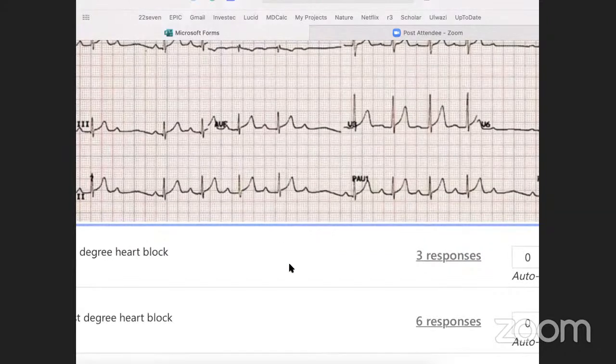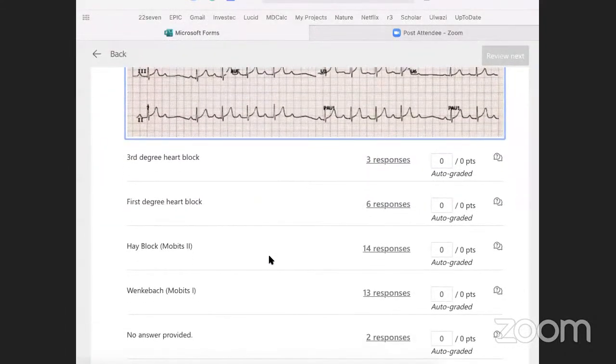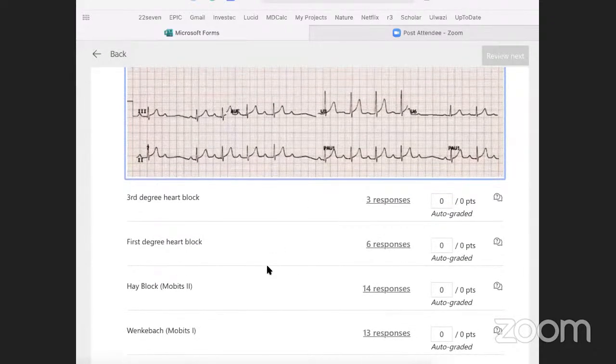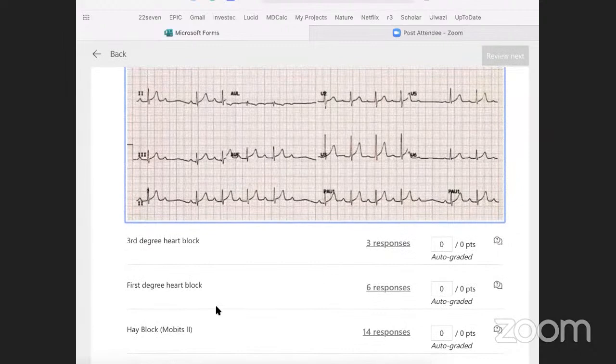And by measuring out my Ps and then using that on the RRR line to see if they are the same or they're different, that determines my disposition for this patient. So as we said, if it was a Mobitz 2, this is a high-grade block that the patient is at risk to develop a symptomatic bradycardia with severely bad outcomes. But if it's a Mobitz 1, it's just a physiological block and not as sinister.